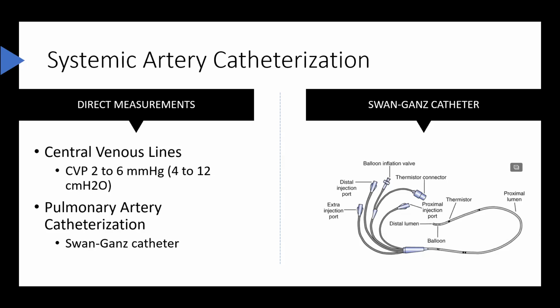The most common problems encountered with insertion of CVP catheters are pneumothorax, hemothorax, and vessel damage. Other potential complications include infection, thrombosis, and bleeding. Placement of the catheter usually is confirmed by radiography.